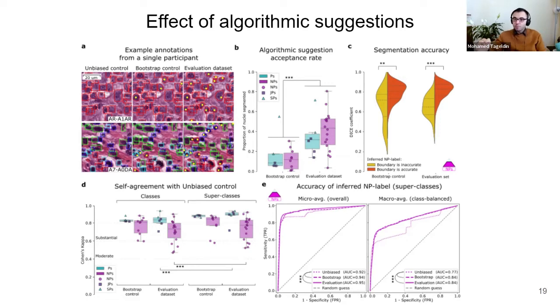They're pretty stable. Non-pathologists, we show that they get biased, right? But they get biased in a positive way. Maybe the difference is not very clear here, but if you look, for example, at Cohen's kappa, which is the variability between the non-pathologists, you can see that the variability among them decreases when we show them the improved classifications with mask RCNN smoothing, and the accuracy of their classification.